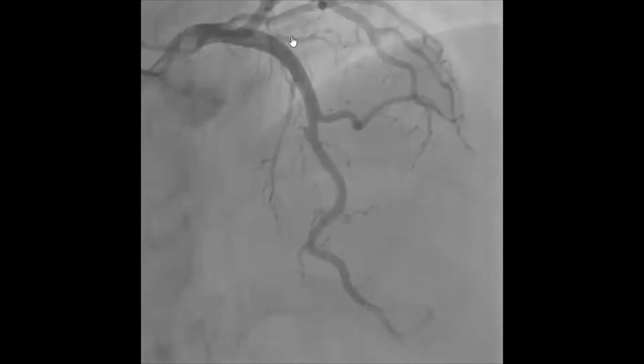So one small diagonal branch here, another diagonal branch here, another small diagonal, another small diagonal, and the LAD goes all the way to the apex. Now, the branches on this side are the septal branches, the septal perforators. Septal perforators, on the cranial views, are always on this side of the LAD. All of these are septal perforators. They go down and penetrate the septum.